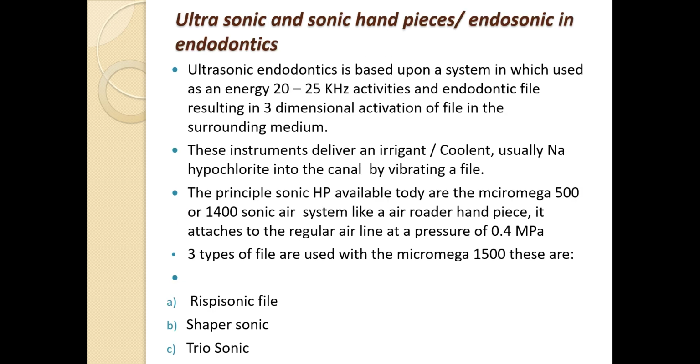Coming to ultrasonic and sonic handpieces, or endosonics, in endodontics. Ultrasonic endodontics is based upon a system that uses energy at 20 to 25 kHz to activate endodontic files, resulting in three-dimensional activation of a file in the surrounding medium. These instruments deliver an irrigant or coolant, usually sodium hypochlorite, into the canal by vibrating a file.